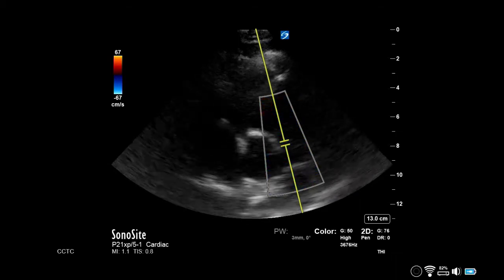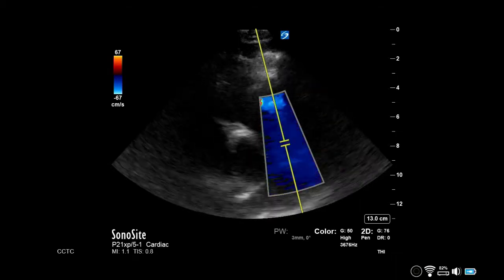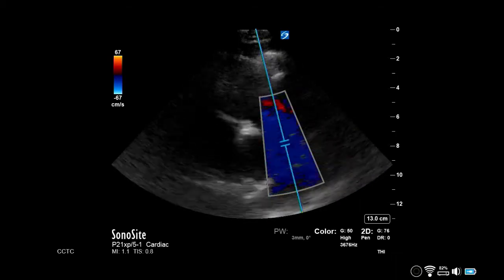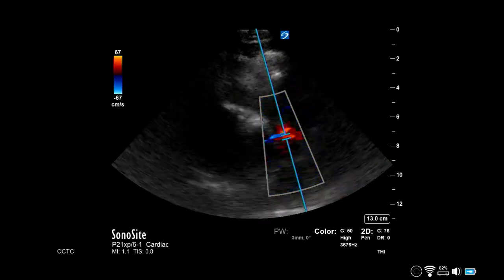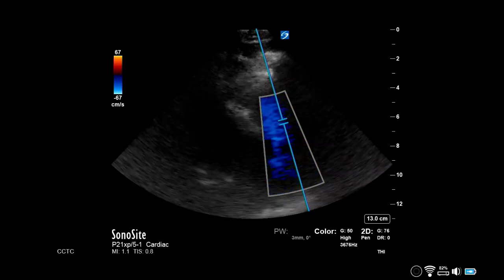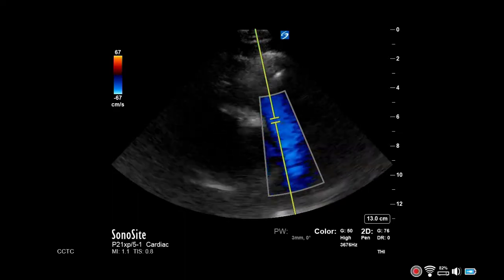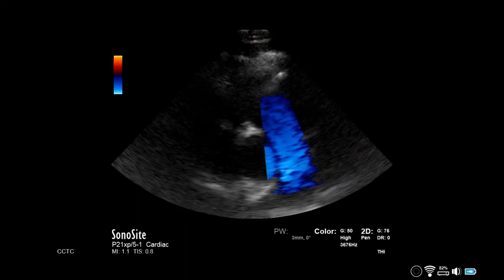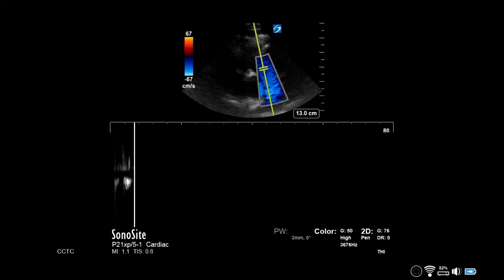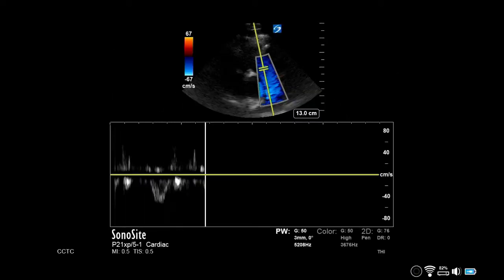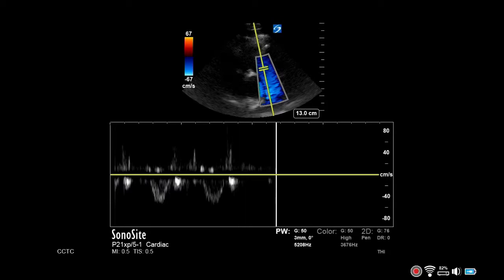Enable pulse wave Doppler and align parallel to the flow. Place the gate directly above the pulmonic valve, then enable pulse wave Doppler.